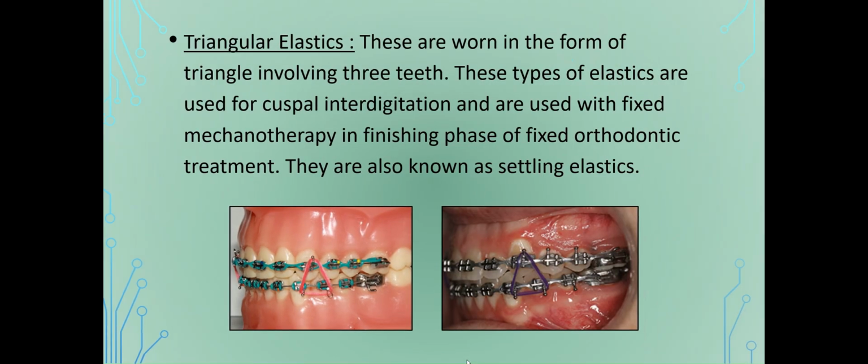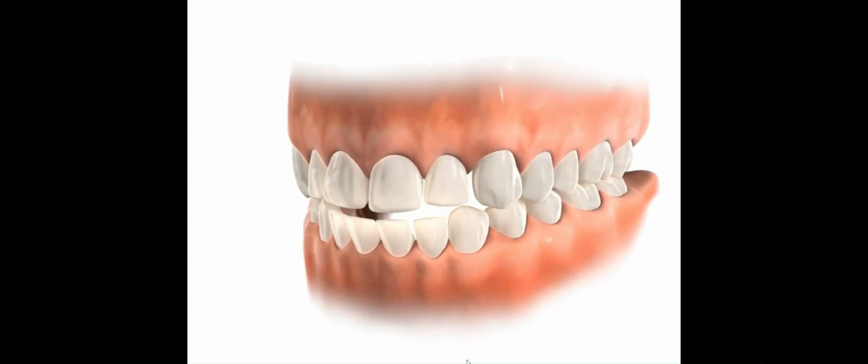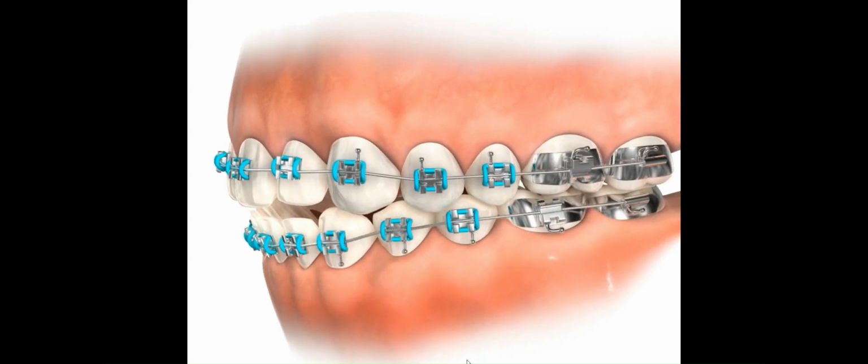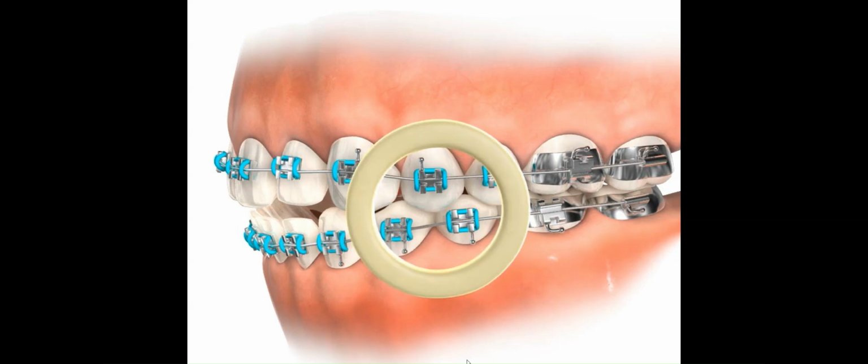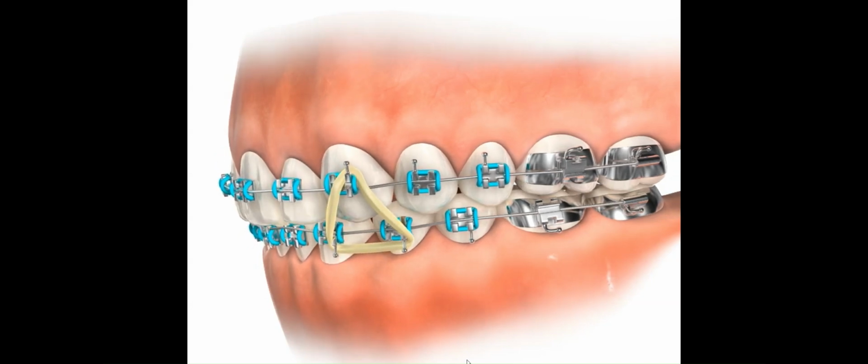Triangular elastics. These are worn in the form of triangle involving three teeth. These types of elastics are used for cuspal interdigitation and are used with fixed mechanotherapy in finishing phase of fixed orthodontic treatment. They are also known as settling elastics. To visualize in a better way, we can see the elastic is worn involving one tooth in maxillary arch, that is the canine, and two teeth in the mandibular arch, that is canine, and the premolar.